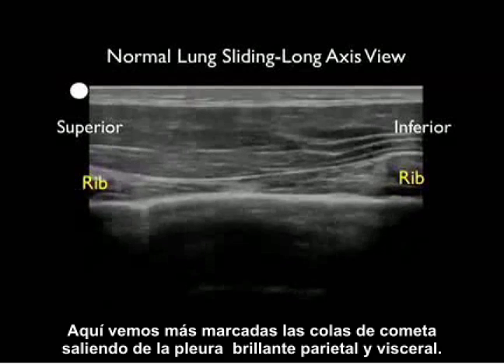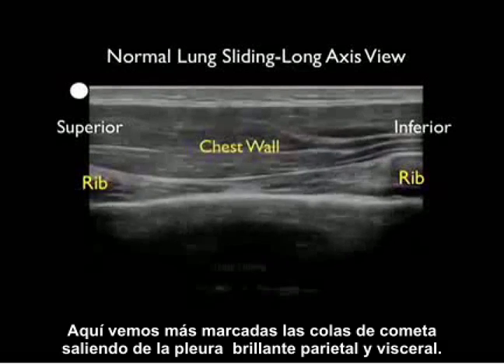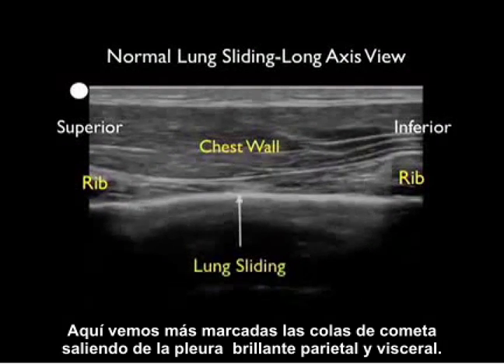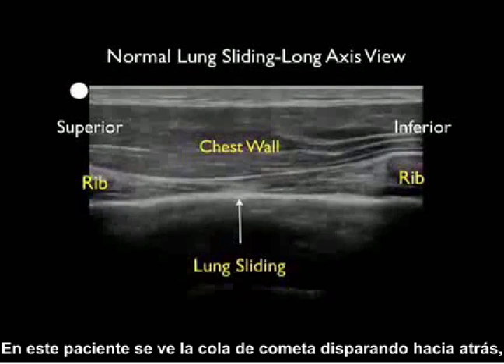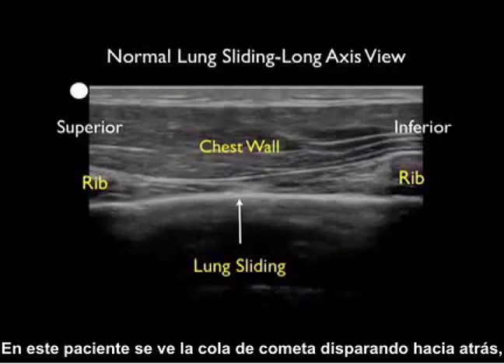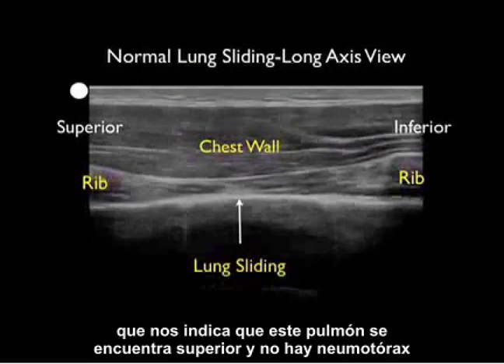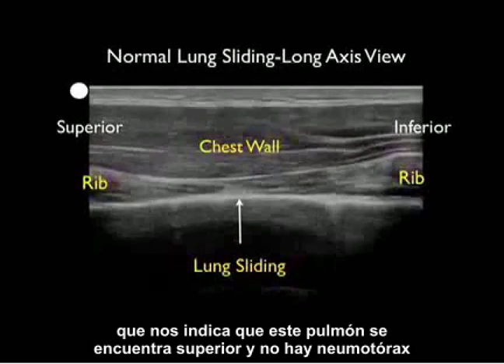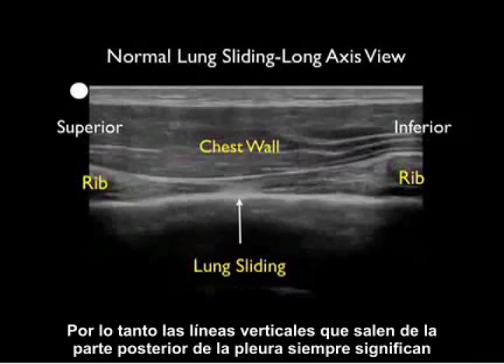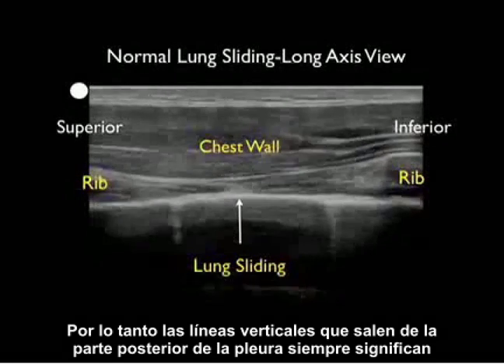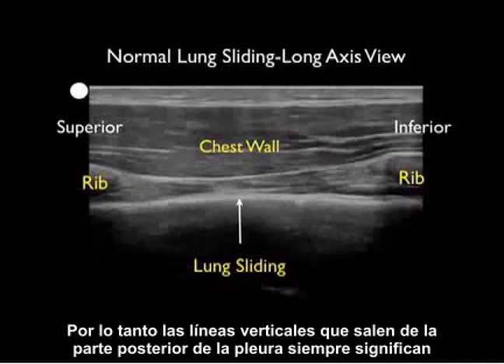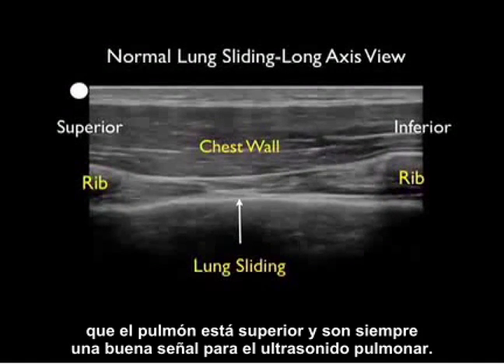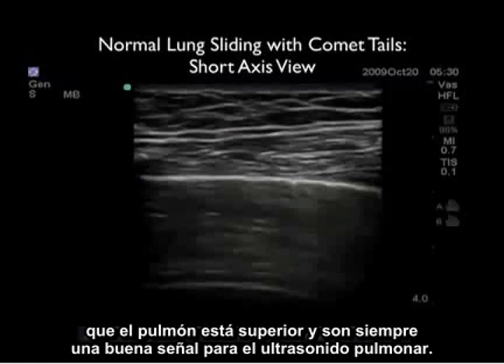Here we see more dramatic comet tails coming off the shimmering parietal and visceral pleura. The comet tail shoots off the back, telling us that this lung is up and there's no pneumothorax. Vertical lines coming off the back of the pleura always mean that the lung is up and are always a good sign on lung ultrasonography.